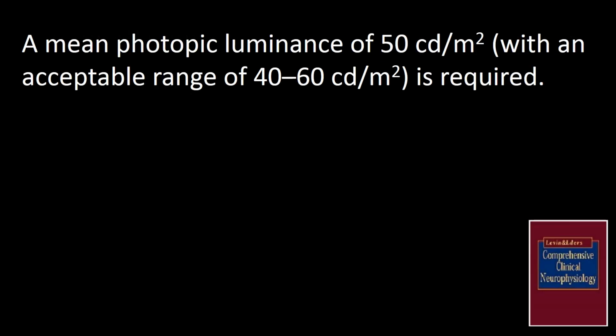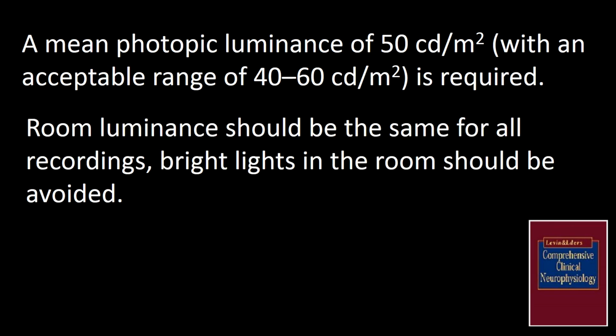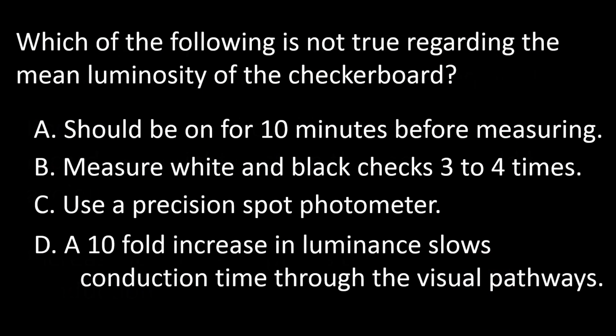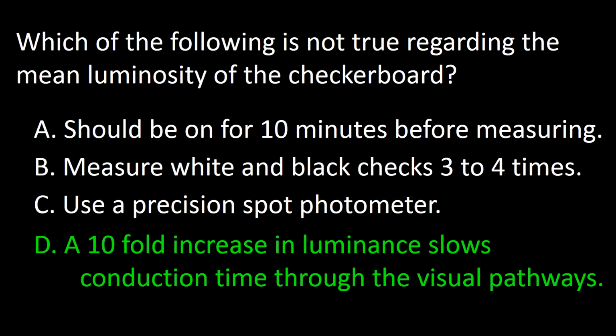A mean photopic luminance of 50 cd per square meter is required. Between 40 and 60 candelas per square meter is accepted. Room luminosity should be the same for all recordings. Bright lights in the room should be avoided. Increased luminosity speeds up conduction through the visual pathways. So the answer to this question is D.